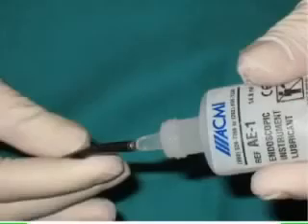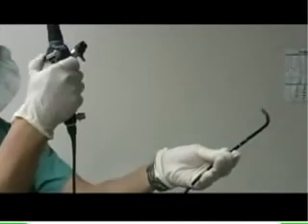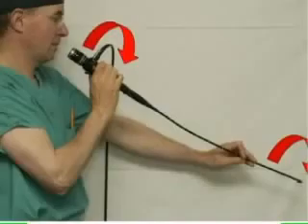The lens of the bronchoscope can be defogged using silicone solution or simply by holding the tip of the scope in warm water or against the buccal mucosa for a few seconds prior to use. The scope is held such that the right thumb is on top of the flexion lever. Moving the lever downward flexes the tip of the scope upward toward the 12 o'clock position. Conversely, moving the lever upward flexes the tip downward toward the 6 o'clock position.